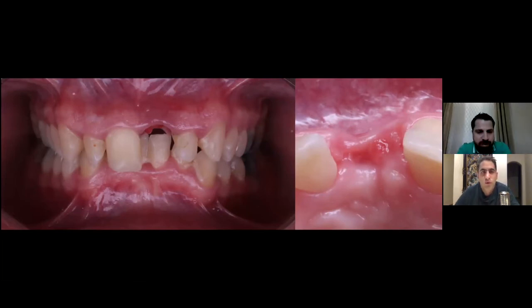I'm gonna go through the second one quick. Unfortunately, we're not gonna talk about the prosthesis or the prosthetic part because we don't have much time. The patient came with his central slightly attached to the soft tissue, and it was really moving, and he was removing it with his hand. He came to me with this situation, of course, poor oral hygiene that we have to enhance, a lot of perio things to do here, but he was basically concerned about the central that he's lost.